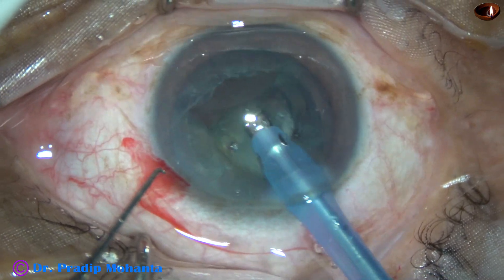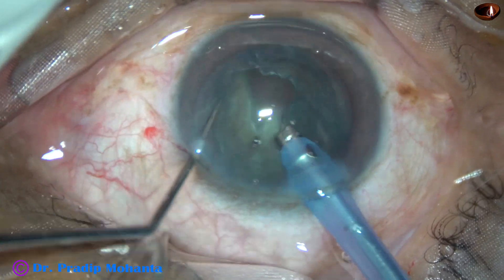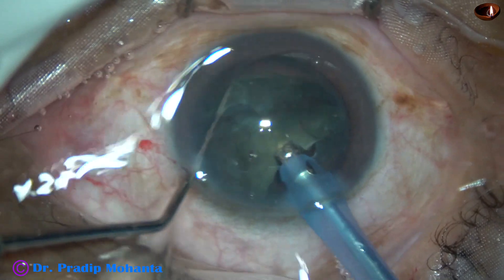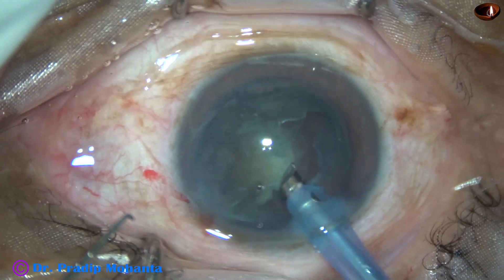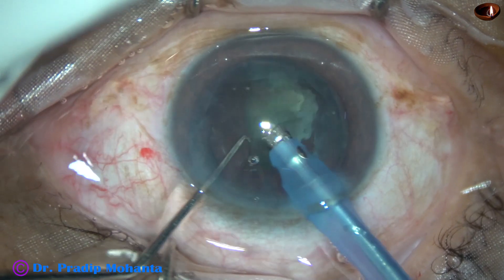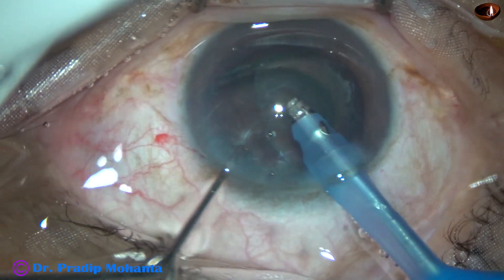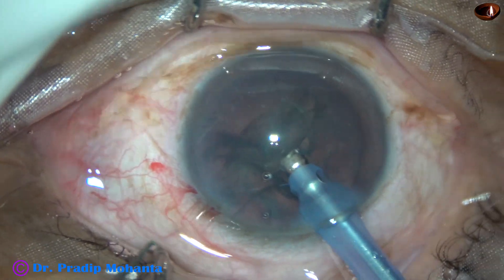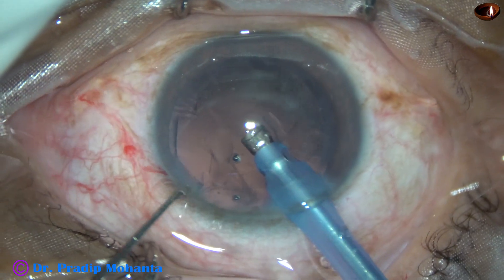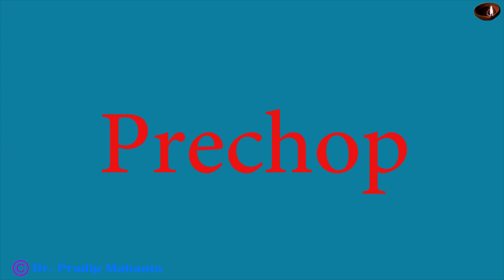I have got the second piece in front of the phaco needle and it is emulsified. Now I turn and go to the other hemi-nucleus, divide it into two pieces and emulsify. Now we have a carpet of epinucleus — just tumble this epinuclear sheet and emulsify it. This is one way of managing the nucleus with the phaco needle itself.